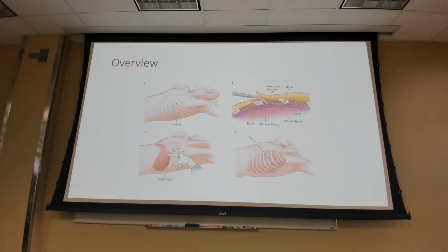All right, so here's our overview and where we're going. Obviously we recommend between the 4th and 5th rib, or 5th intercostal space, at the mid-axillary line, and we want to make sure we're well above the diaphragm. In men, we typically say the nipple line. A good rule of thumb, I was trained one up from the nipple line, but the nipple line is the appropriate or the textbook location that we place these.